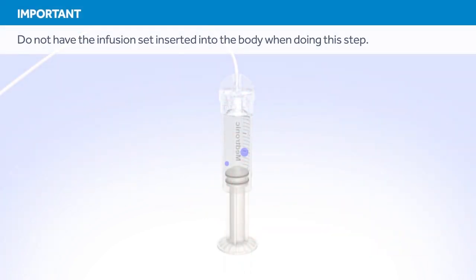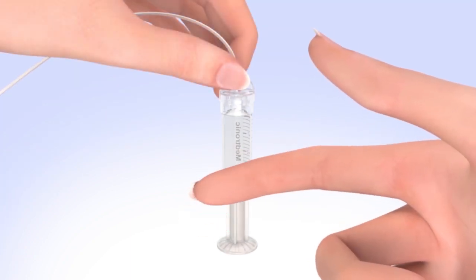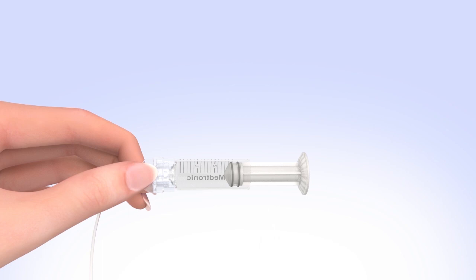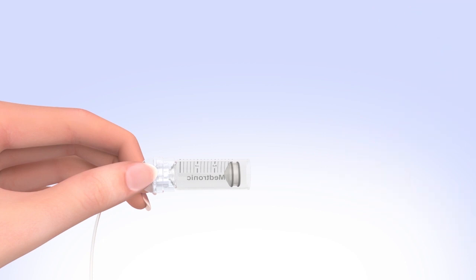You should not have the set inserted into your body when doing this step. Tap the reservoir to make any air bubbles rise to the top. Purge the air bubbles that have risen to the top by slowly pushing up on the plunger until all of the air bubbles have been pushed out of the reservoir and you see a small amount of insulin in the tubing. If you're not able to push insulin into the tubing, disconnect the tubing connector and then reconnect it. Unscrew the plunger rod counterclockwise until it completely separates from the reservoir. Be careful not to pull down on the plunger as you unscrew the plunger rod and avoid squeezing the O-rings. The reservoir is now filled and connected to the tubing.